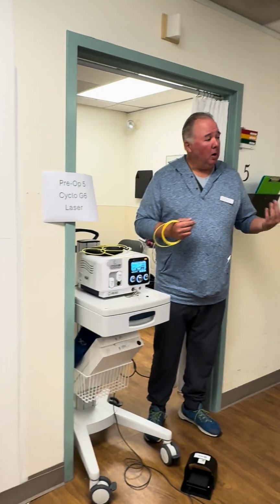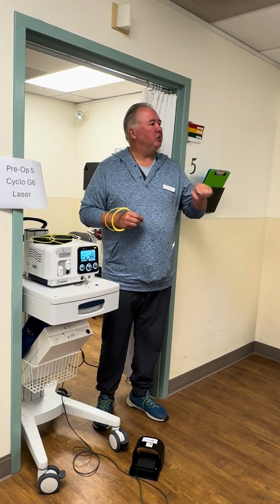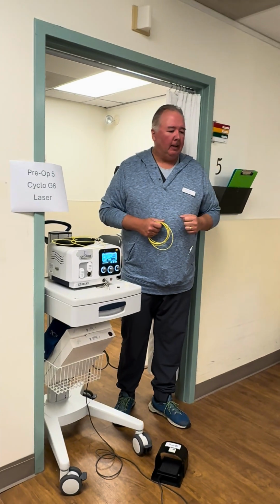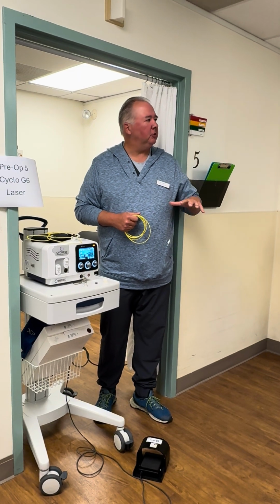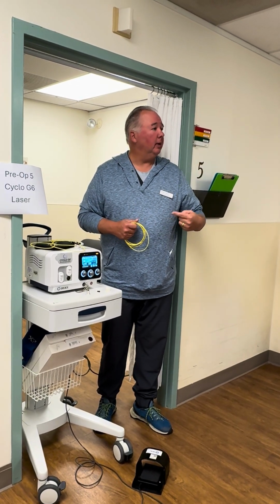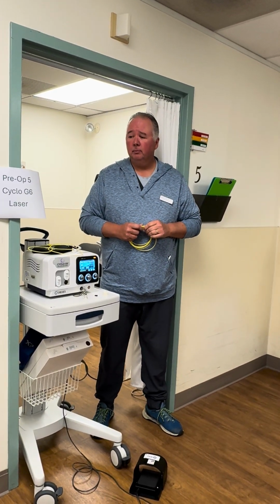That helps sometimes. So that's just a little caveat for you guys to know. If you see this red angry eye, you might be seeing that patient again, because the one thing about micropulse is you can repeat it. So if the patient, let's say, has a micropulse done and 9 months later the pressure starts to rise, the doctor can always bring that patient back, do micropulse again, use the same dosage, and maybe the next time around they'll get 2 years out of it.